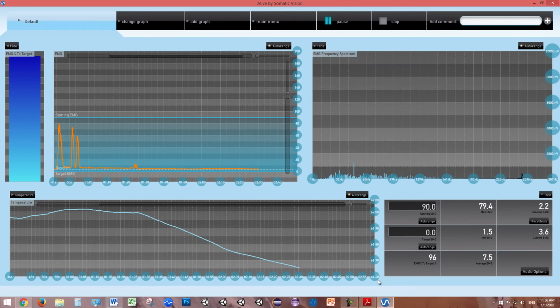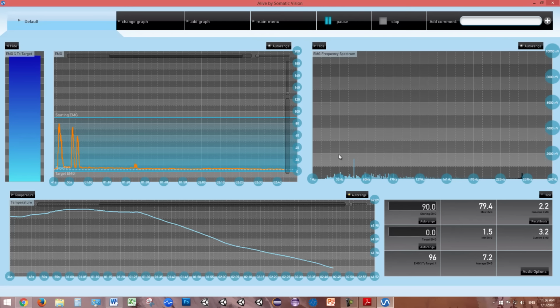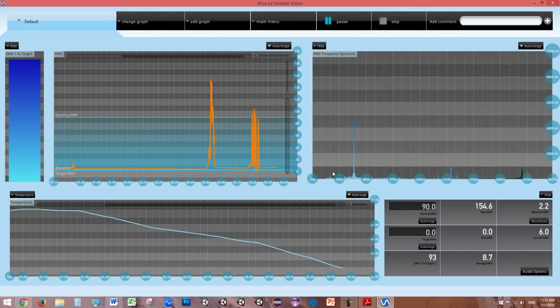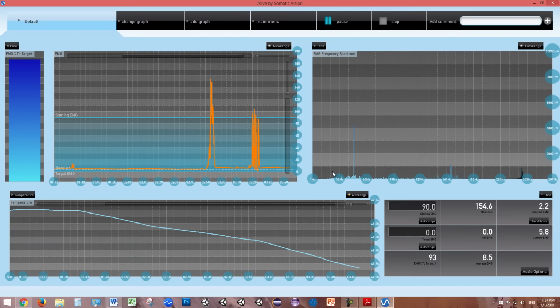For EMG, if you have electrical interference or a bad connection, you will see a large spike around 50 or 60 Hz. The spike shown here on this screen is small and won't interfere with EMG training. If you see a larger spike, you may wish to reapply disposable electrodes, add conductive paste like Ten20, choose a less hairy training place, or move the GP8 amp away from electronics.